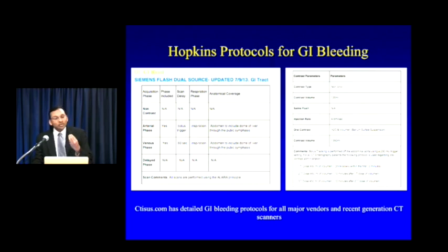And honestly, our image quality for these studies is exceptional. And I think that we've found the study to be very sensitive and specific. And our clinicians have really bought in. Our ER physicians now order this study all the time.